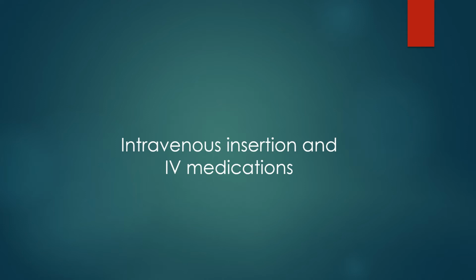Hi guys, we're going to look at how to start an IV and how do we make that safe for our patients. We've already talked about central lines. That central line is any IV or vascular access that ends at the superior vena cava. Today we're just going to talk about those peripheral lines.